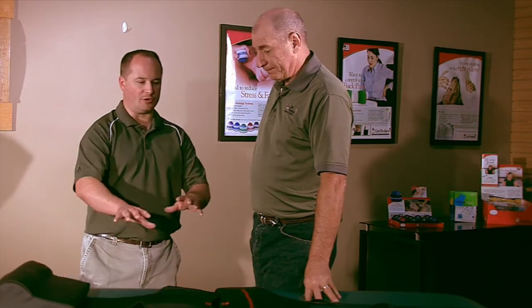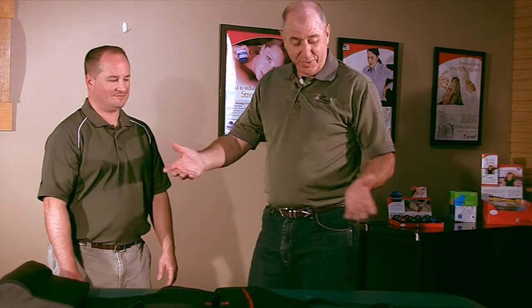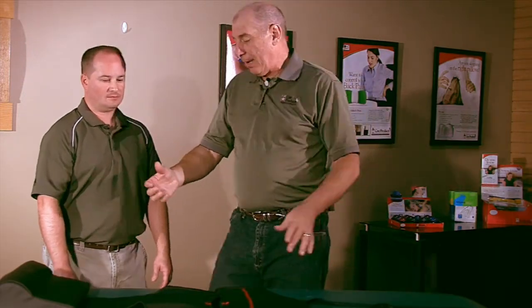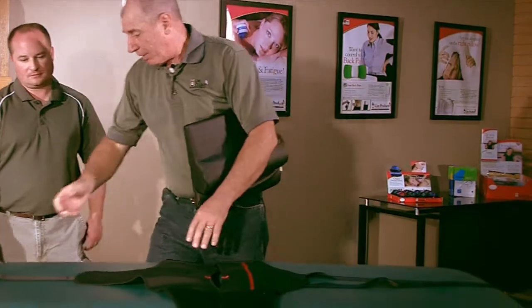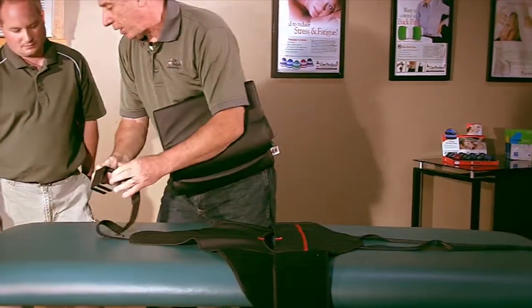Now, how does this really hook up on the table? Unfortunately today we're using a massage table, so this isn't, as you know, a traction table, but it is very much like most traction systems where this would go on the end of the table, this would go around the cushion, and this would give you your counter traction.